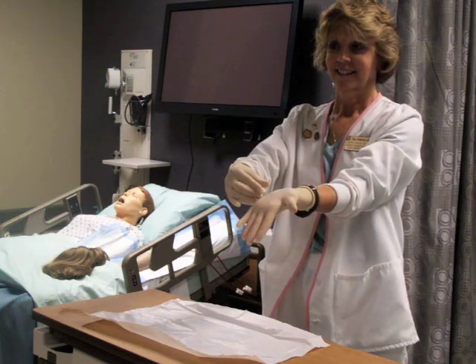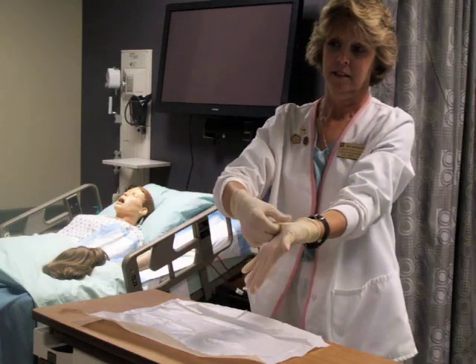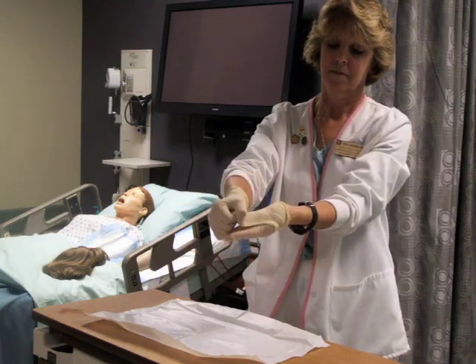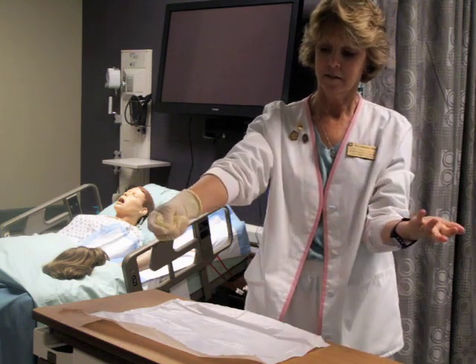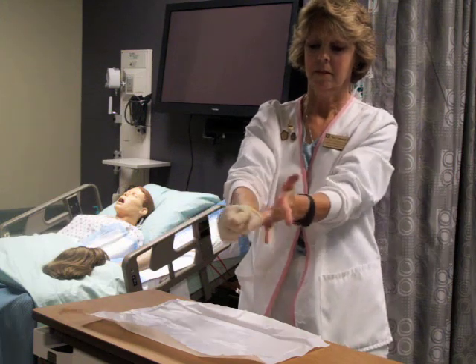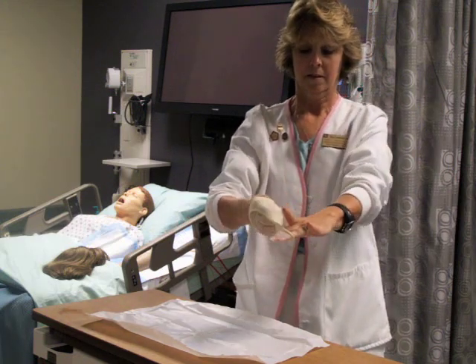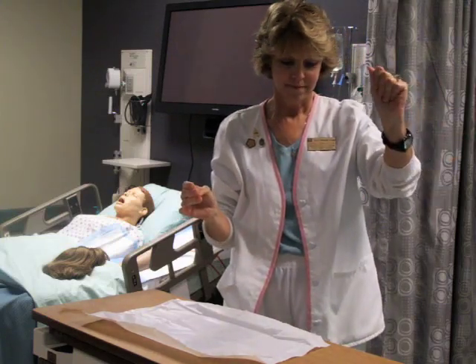Removal of sterile gloves after the procedure is done by simply grasping the thumb area, pulling over the fingers, and removing it — placing it into the sterile gloved hand. Then skin-to-skin is achieved by sliding the fingers under the glove cuff, removing the gloves, and discarding appropriately.